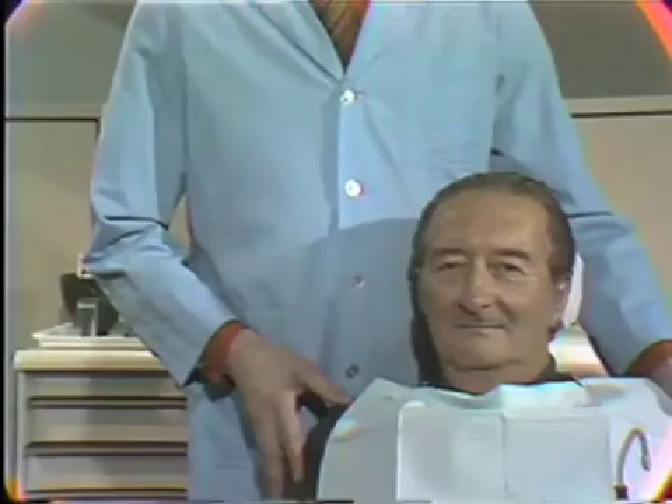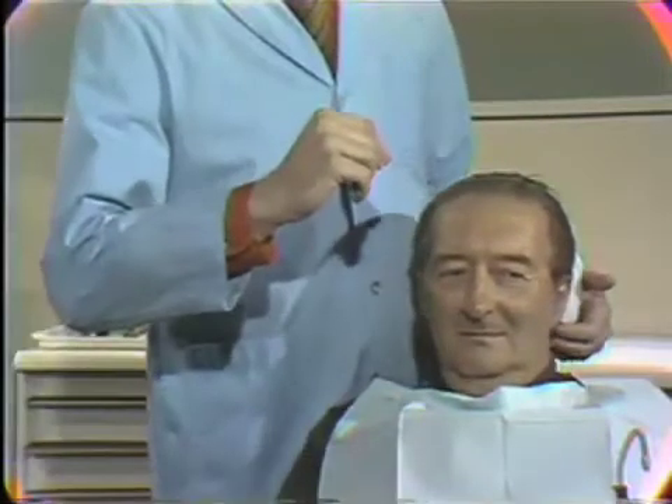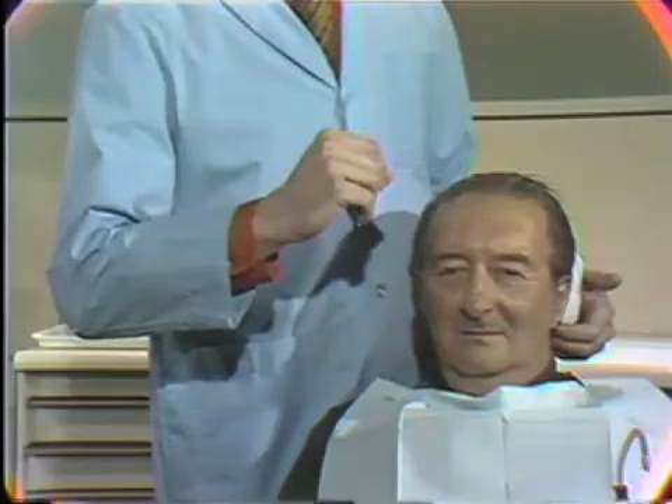After positioning the patient with the chair upright, the head supported in the headrest, and the patient's mouth at the approximate level of the operator's elbow, we are ready to select the proper tray.